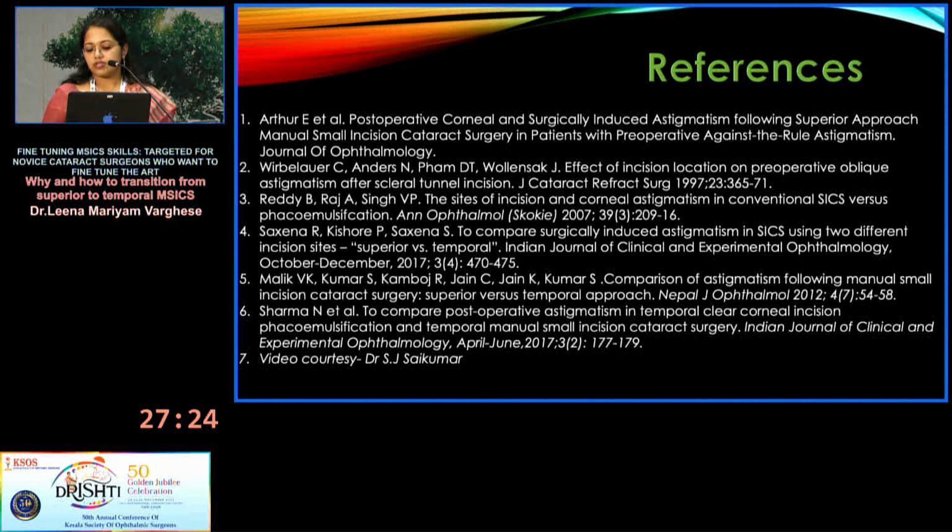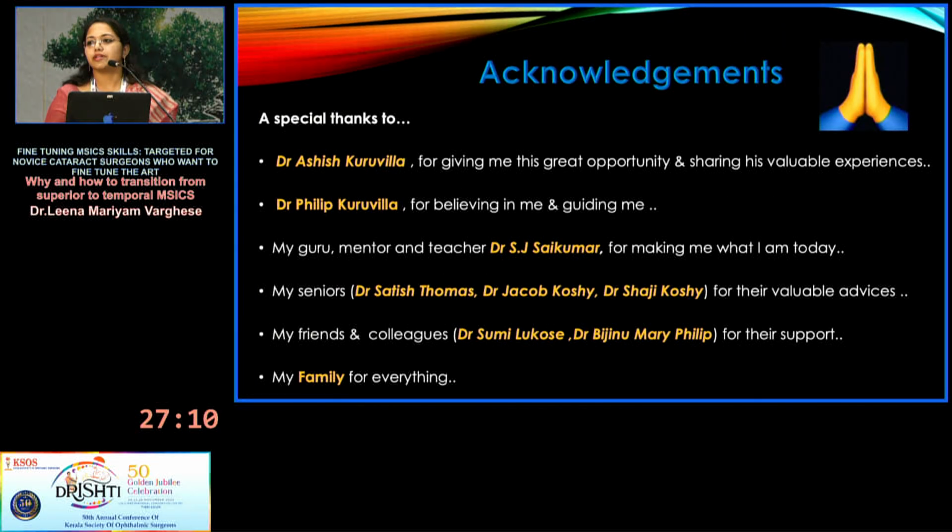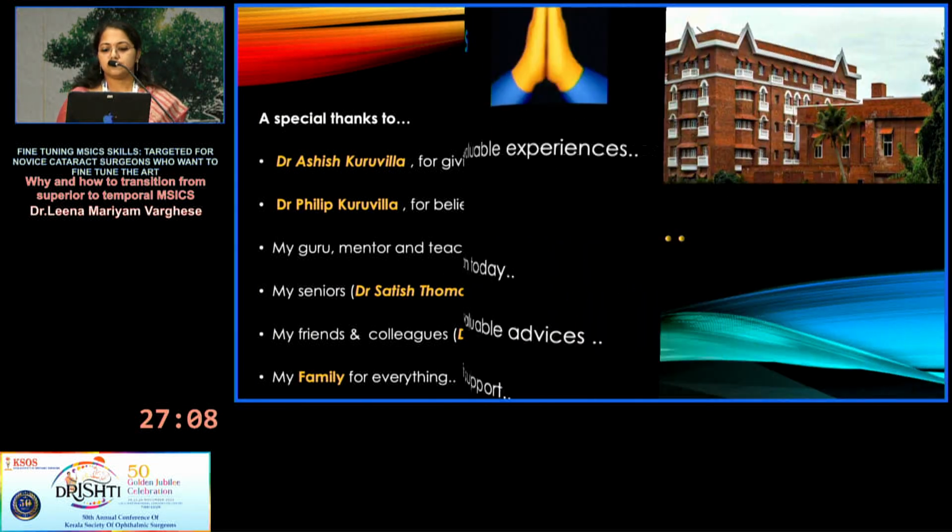So these are my references. So the take-home message is mainly that you'll have a slightly difficult nucleus delivery. So for that you need to have a second instrument and always plan a temporal SICS in case of against the rule astigmatism. These are my acknowledgements. Thank you.